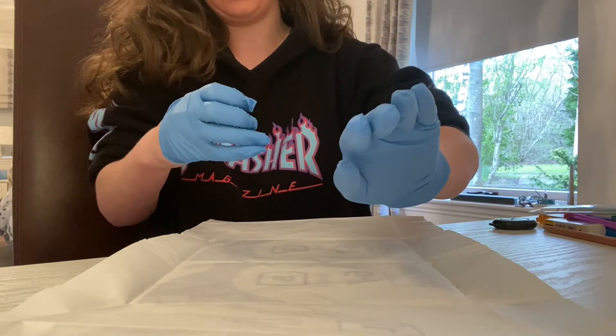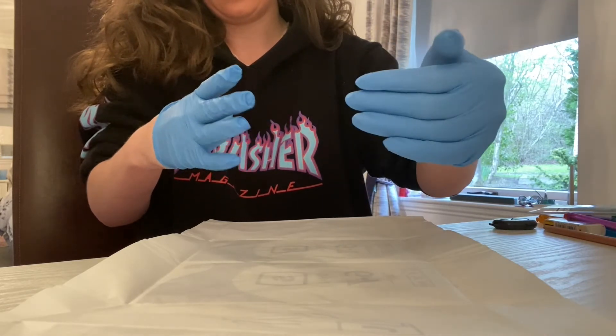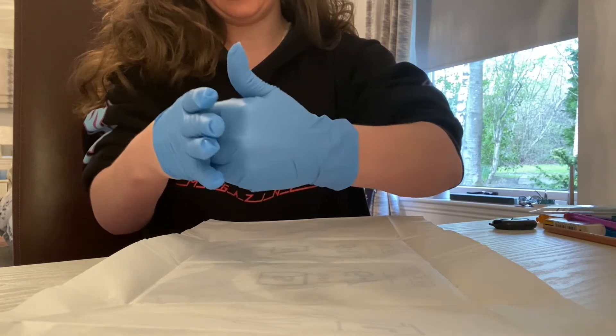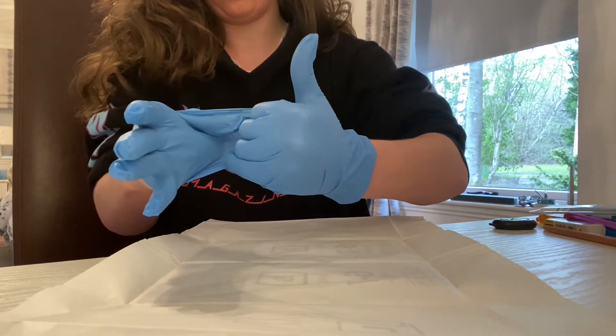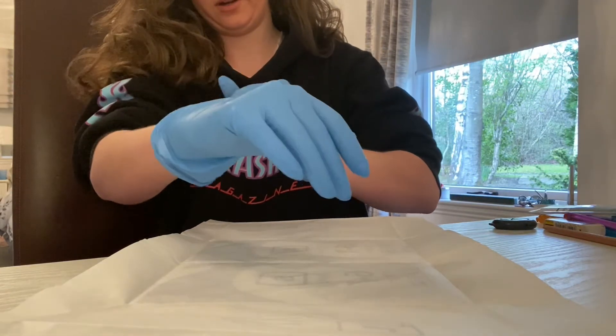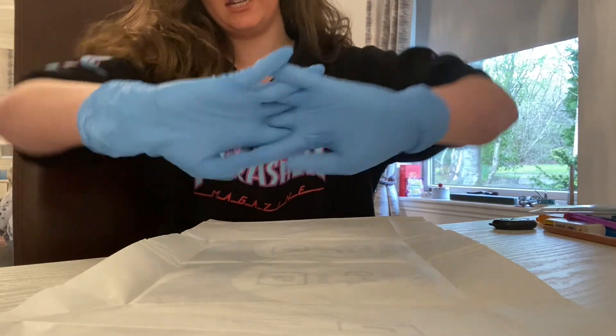I then carry out the same mechanism with the left hand to right hand, sliding in, pulling over, keeping the left thumb out of the way, and pulling on. Both gloves are on and I am ready to go.